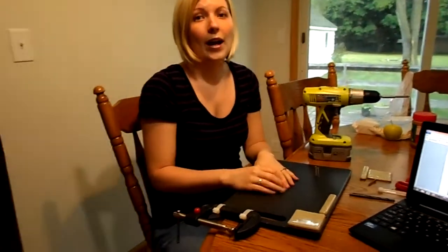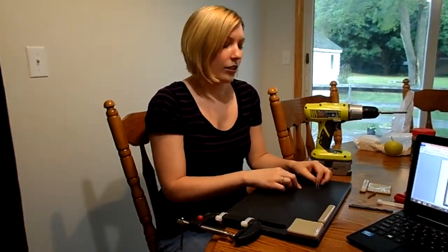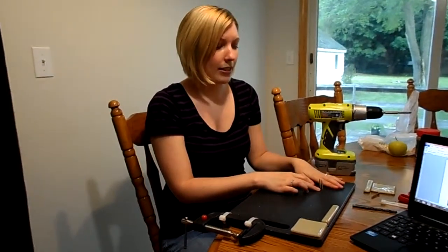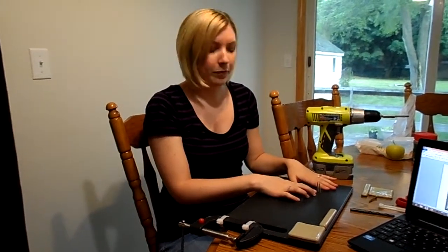Next, I'll show you how I made the cutting board. The first thing you want to do is go ahead and decide where you want your screws to be that are going to hold the food in place. So I decided that I would place the screws over here.